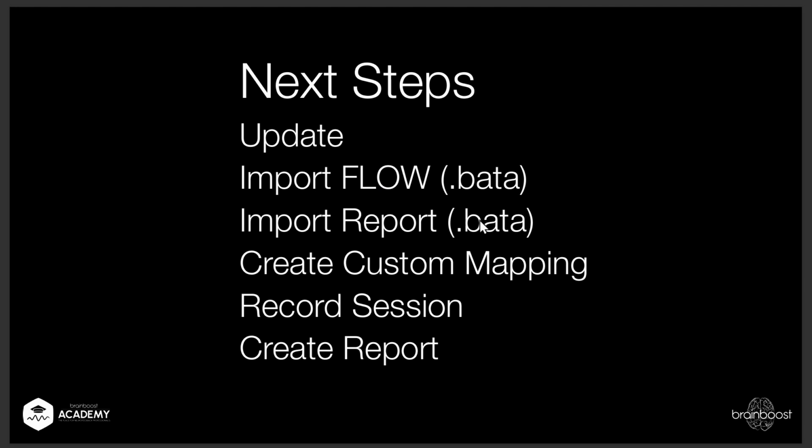For that, you need a certain file, like a .pdf. In our program, the Brain Assistant is called .bata. These two files I will send you, for everybody that is in this webinar, via email. It should be on my email list. If you're not, you can email me.